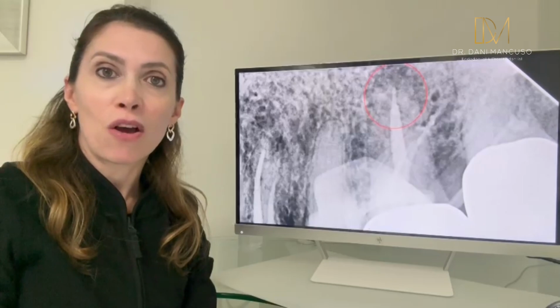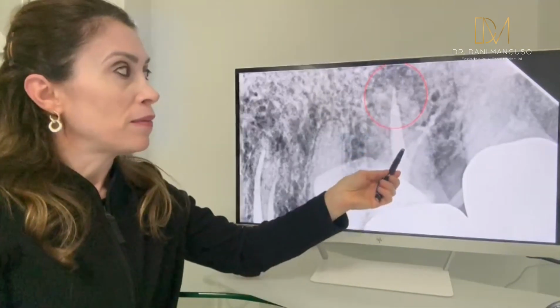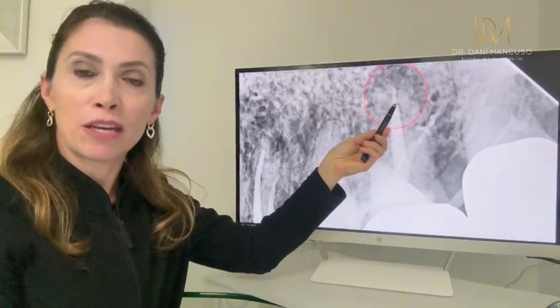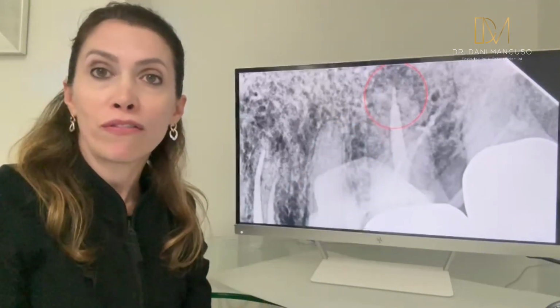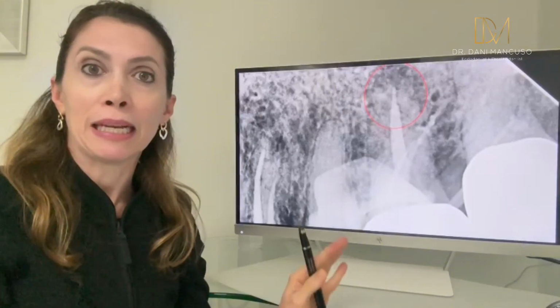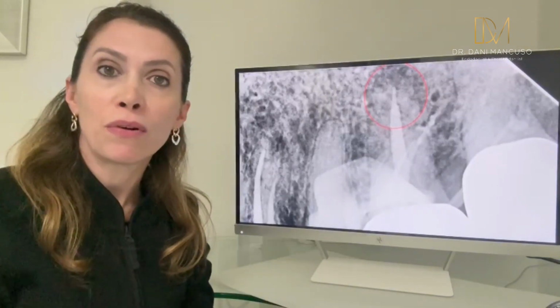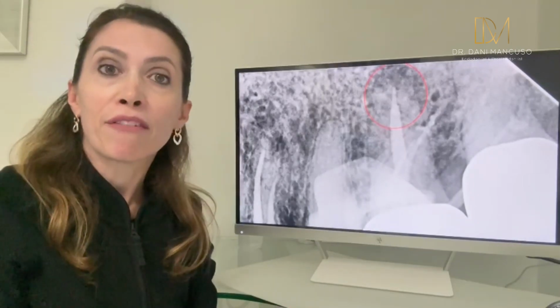This is the x-ray of the cone fit. As you can see here, that is the palatal root. The GP has reached the apex. However, there is this step here showing that I've got sealer and I haven't got sealer. There are lots of voids in it, so the GP is probably too thin for that canal. If I had finished the obturation and left it like that, that's when you have voids and you can have bacterial growth and a very weak seal, and your root canal treatment can fail.